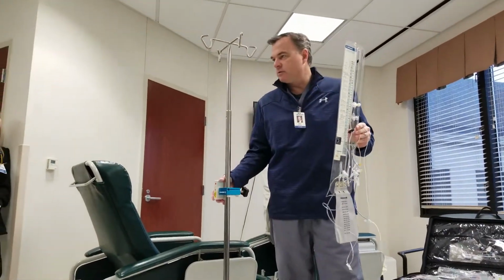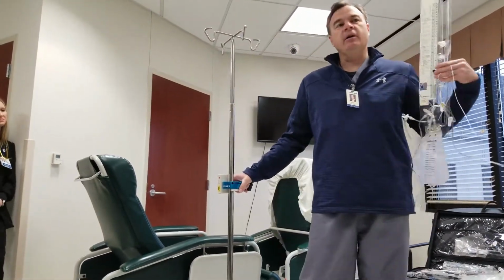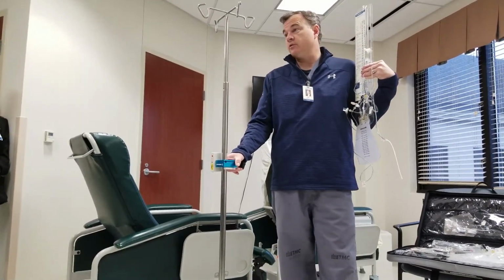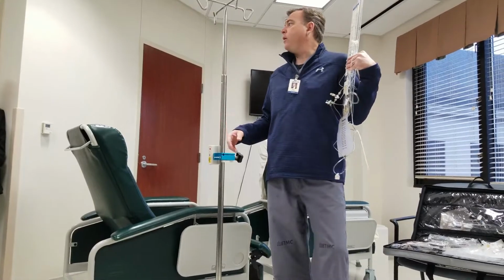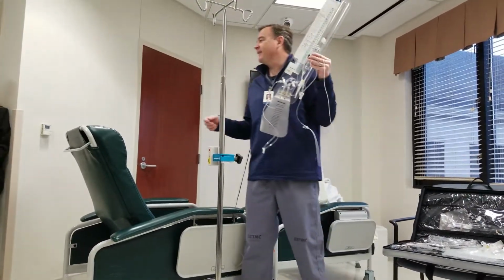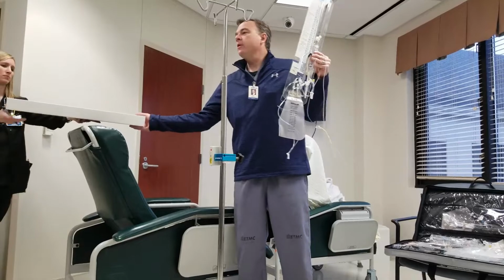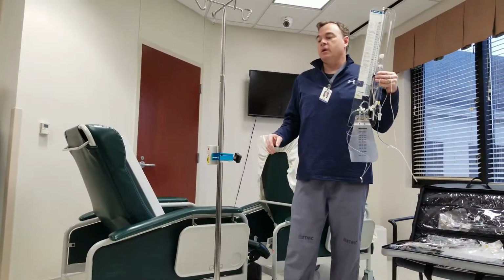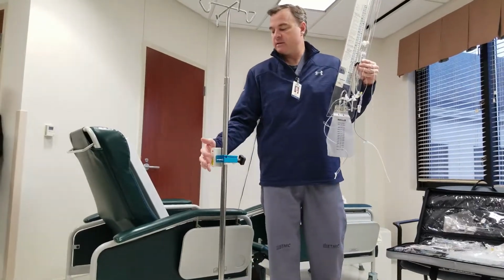And this has got a laser level. This drain is actually double duty. It's primarily a ventricular drain, right? So in that instance, this is actually leveled up.